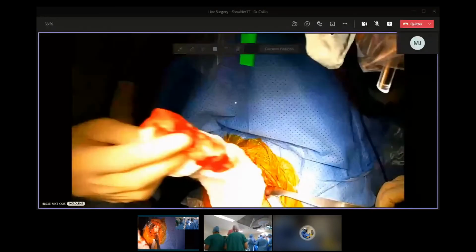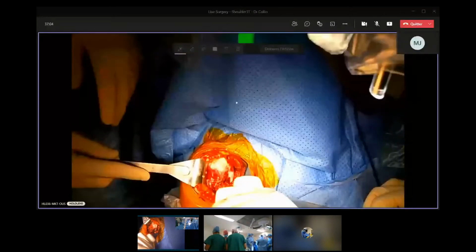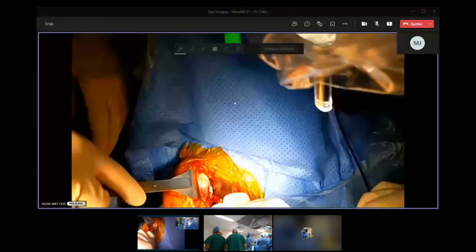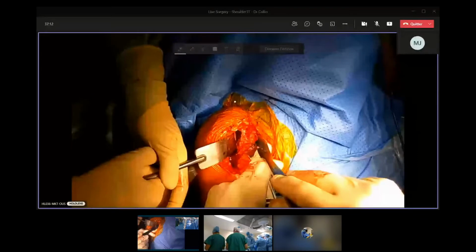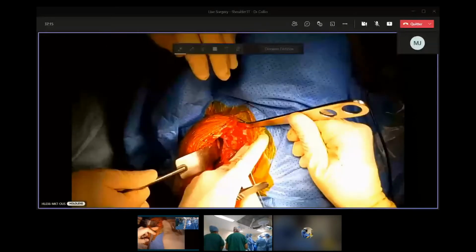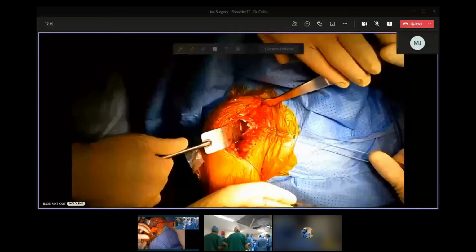You put your Fukuda retractor. And you do it like that. You put your retractor here, and you ask your assistant to pull on the subscap like this. So I would like to spend some time here with you.